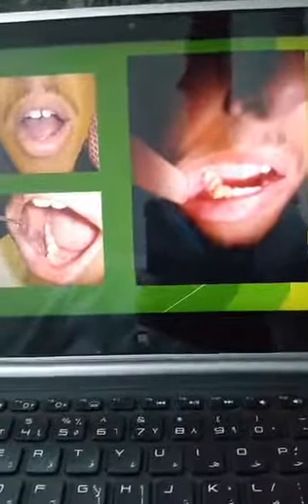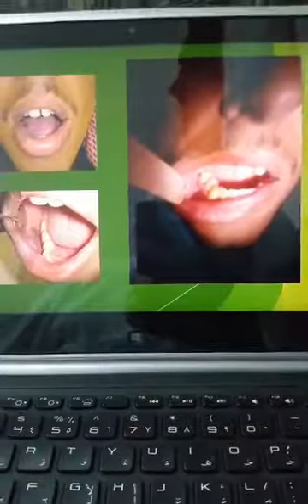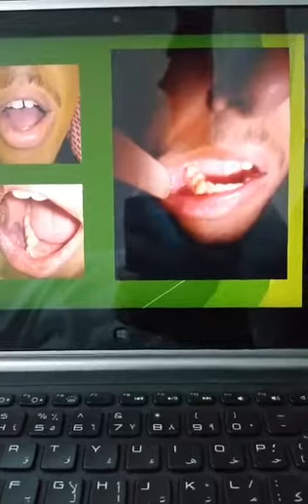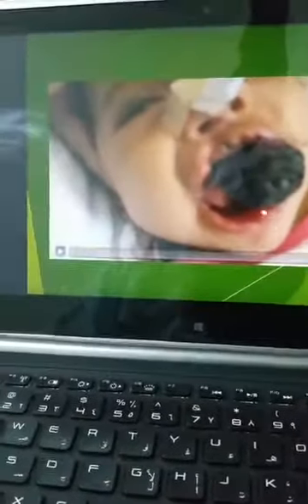the patient actually was very, very happy about the changes in his oral cavity, and he said, I was not able to get married because this is a very huge hemangioma in my mouth. This patient also was treated with laser with less invasive tools, and here you could see the post-operative result.